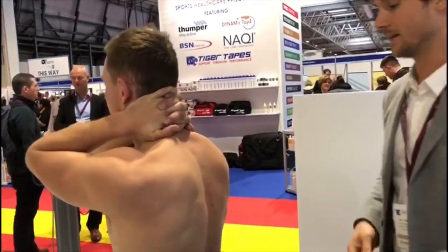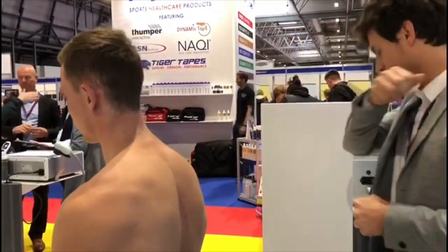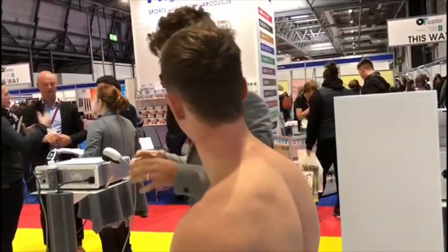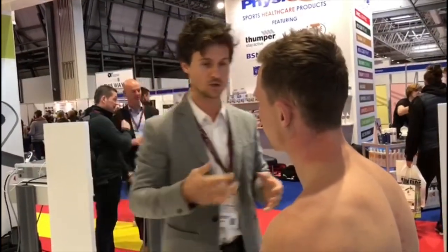So this is quite easy. It doesn't take a lot of time. You can take down your arms. And what we're aiming for is to get a reflective response from the muscles around the joint, but also from the joint capsule itself, just to relax.